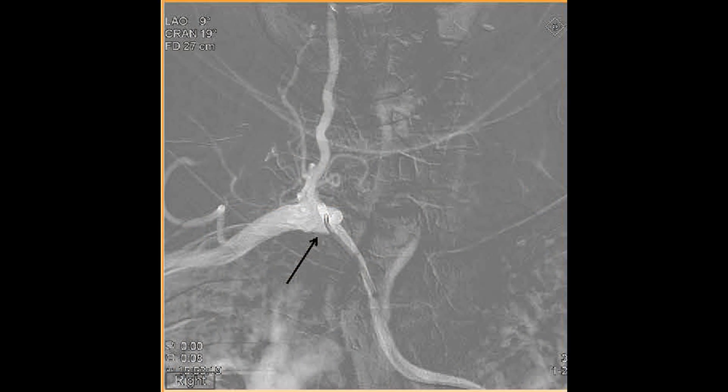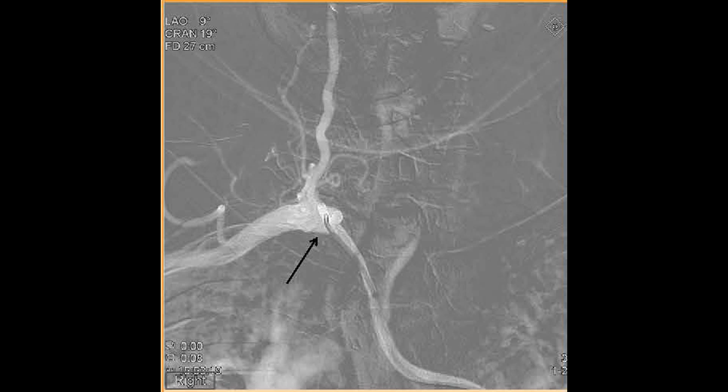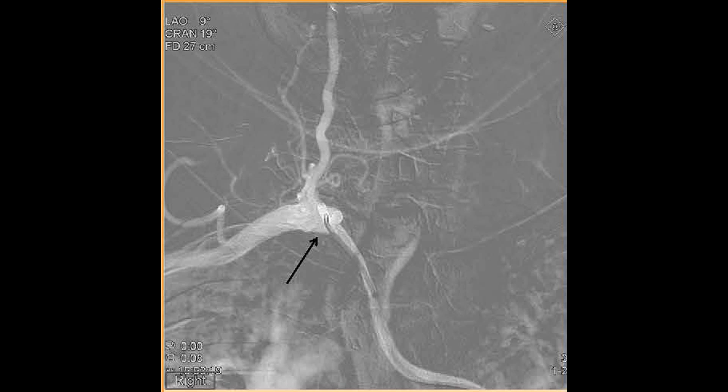Using standard techniques, an angiography catheter was inserted through the femoral artery to the junction of the subclavian artery and the origin of the right vertebral artery. It was estimated from images that the tip of the catheter was 37 centimeters from the aneurysm, and blood was able to pass freely around the catheter into the artery feeding the aneurysm. As such, contrast material was later injected into a semi-open vascular system.